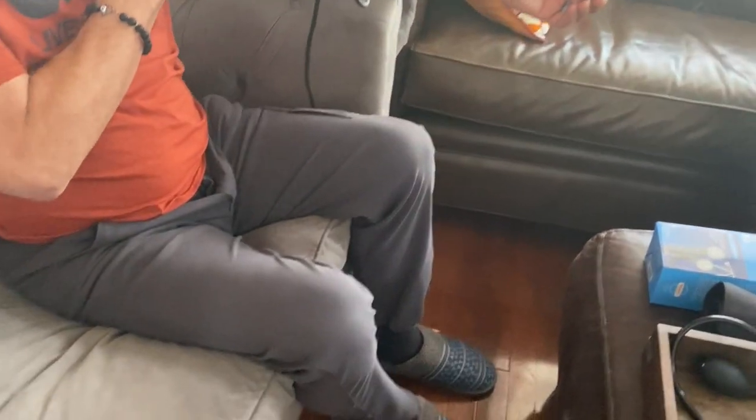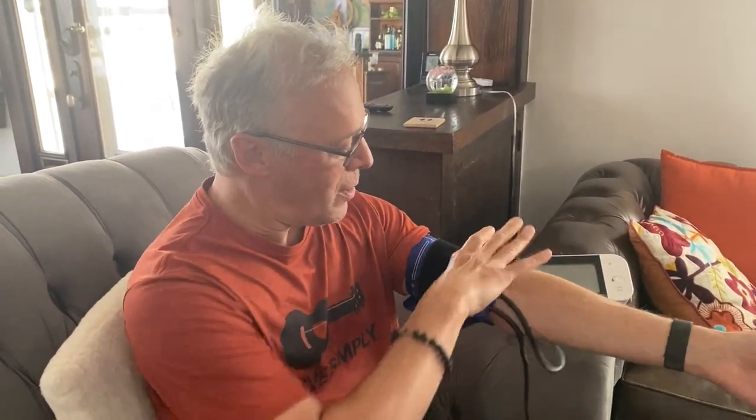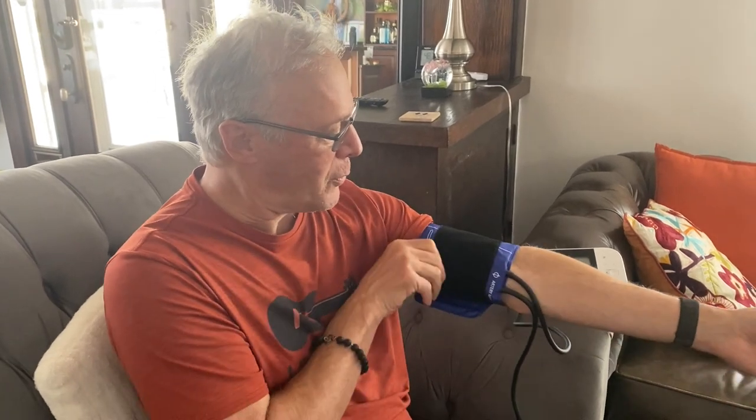Now I'm going to go ahead and put my Walgreens cuff on. When you're taking your blood pressure, always make sure you're comfortably seated. You should have your back against a fairly firm surface and your legs not crossed. This is my Walgreens cuff — the Omron cuff is already taken apart. I've already preset this to be the right size for me, but you have to make sure it's snug but not too snug. You want to be able to get at least a couple of fingers in here — it shouldn't be too tight.